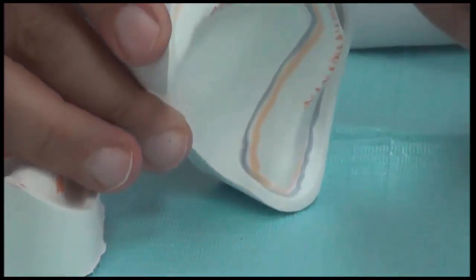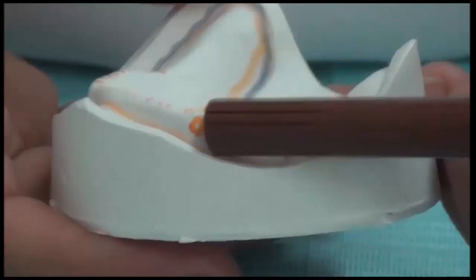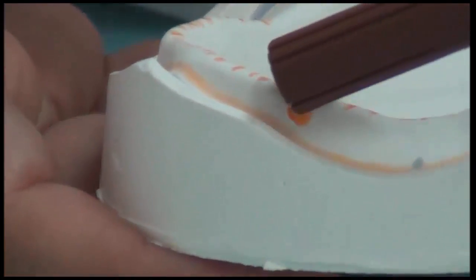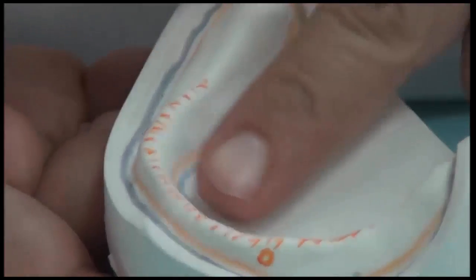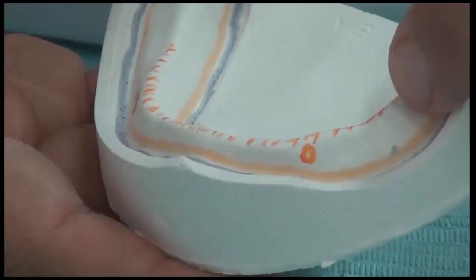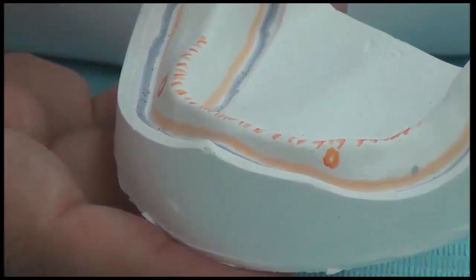And we have openings of foramen. These are the openings, one here and one here, for the mental foramen. So also with a lot of resorption, this foramen might even be on the crest of the ridge, and this is an area of relief. Other than that, the slopes from the outside, from the buccal shelf area, are called the primary support area. The slopes on the lingual are all areas of support.